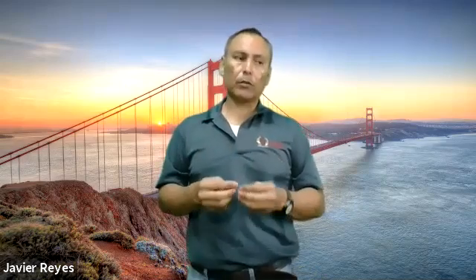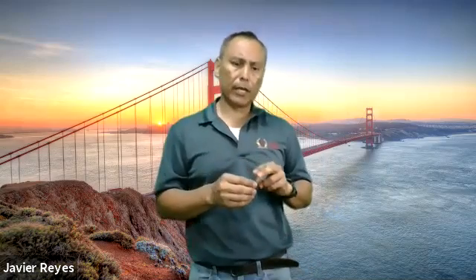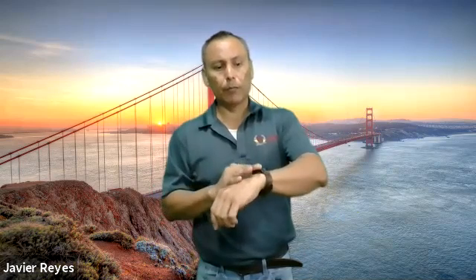The patient identification, and we talked also about this before. When you're going to identify a patient, we need at least two identifiers, as per Joint Commission requirements, and it has to be involved. You have to involve the patient. They have to tell you, my name is, my date of birth is. And you're using the bracelet, their name bracelet, and then your requisition. Very good, your requisition matches the ID band, and they just stated their name and date of birth. That's great. It's really, really important.